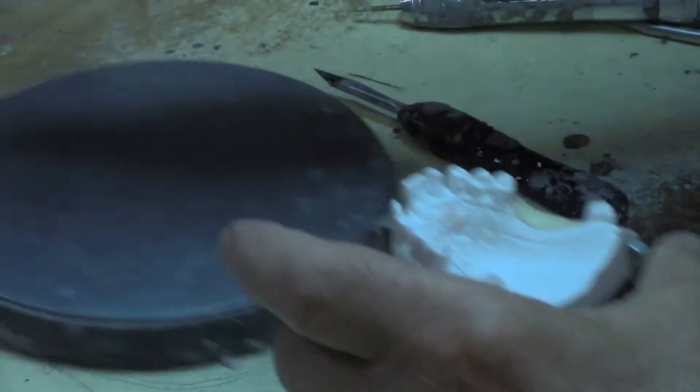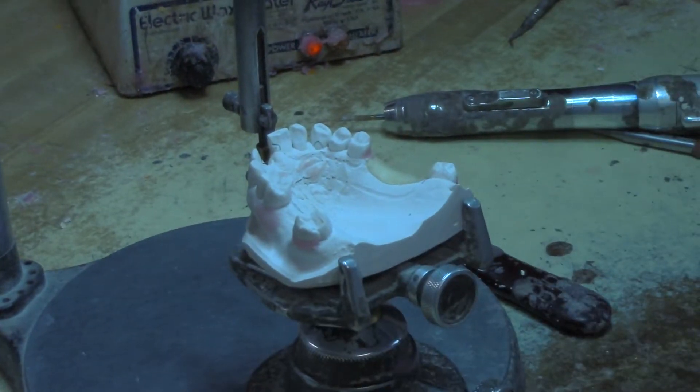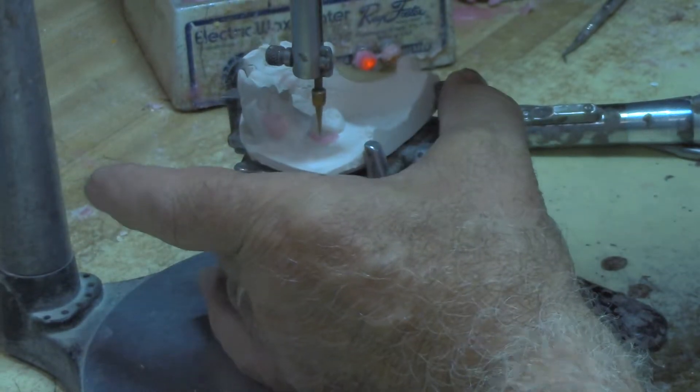Now I'm going to take my other model — this is the master model — and I'm going to do my regular survey. I'm going to survey it for undercuts, and I'm going to do the blockouts. I'm going to do that all over the place; I've done part of it already.